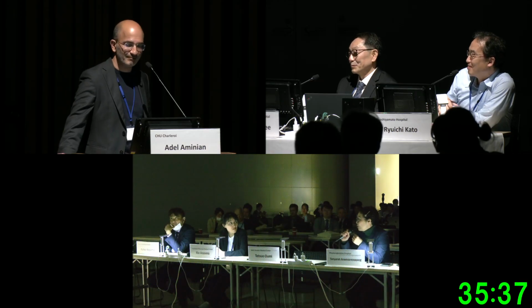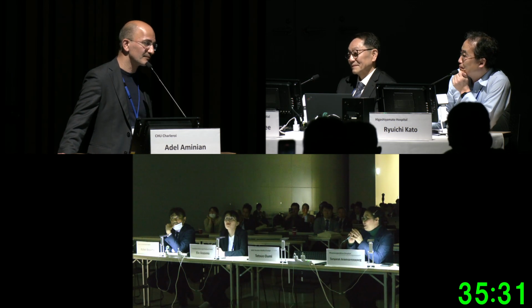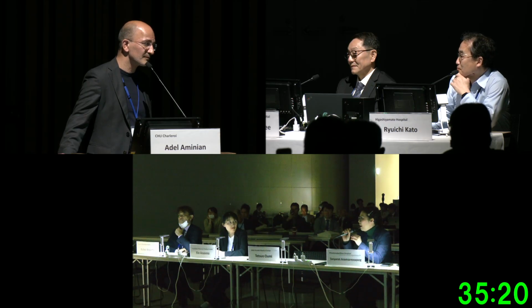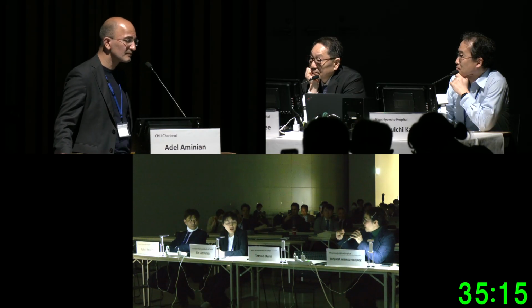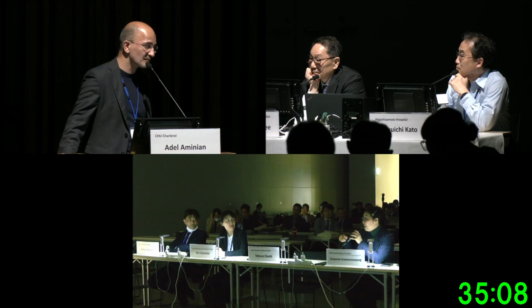I have a recommendation for the starter, because we get familiar with palpation and skin landmarks. For the beginner changing from the routine to ultrasound-guided puncture, it's easy to get a high puncture because of the ultrasound and the thickness of the skin. You puncture and you try to find the vessel, and it's easy to get a high puncture.